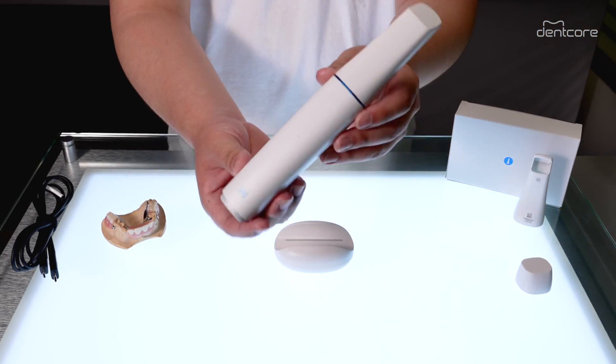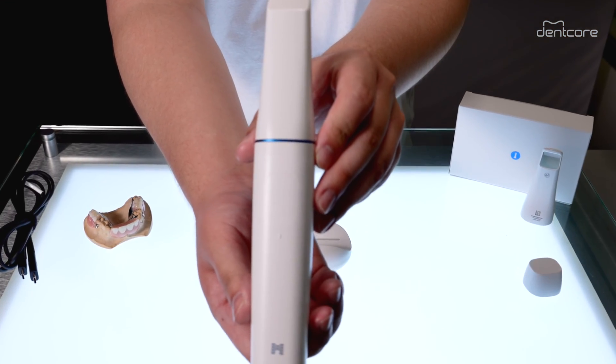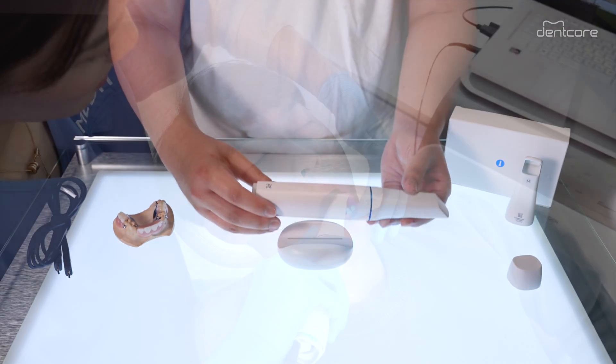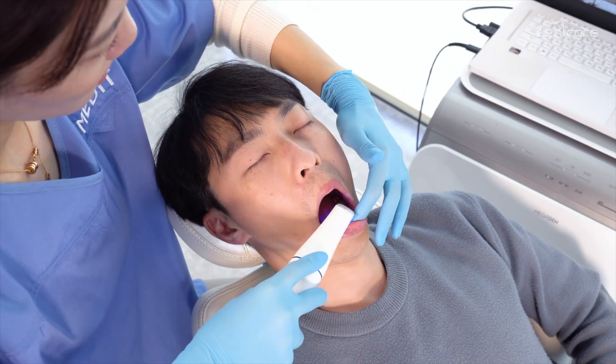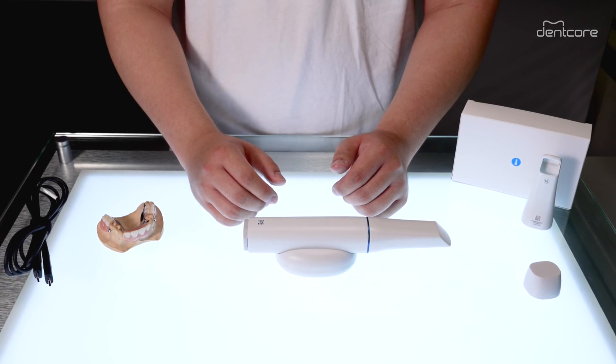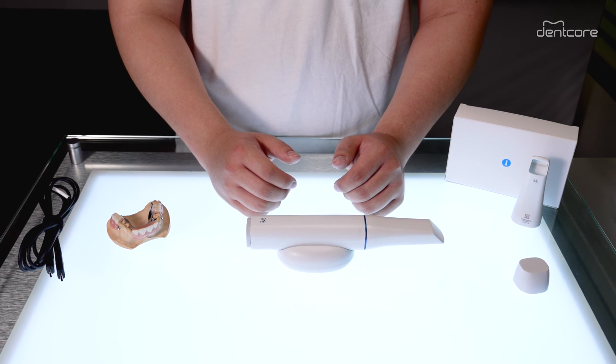So what about the new scanner body? One interesting thing is the new symmetrical and unibody design, which not only enhances comfort for clinicians and reduces fatigue during extended use, but also prevents the risk of cross-contamination and keeps the i900 clean.